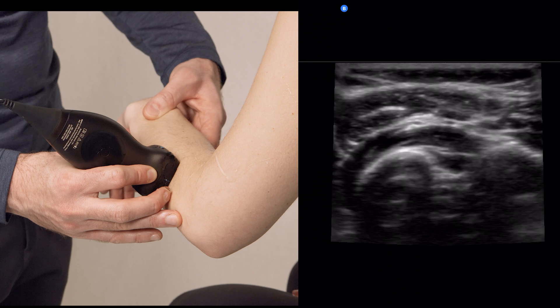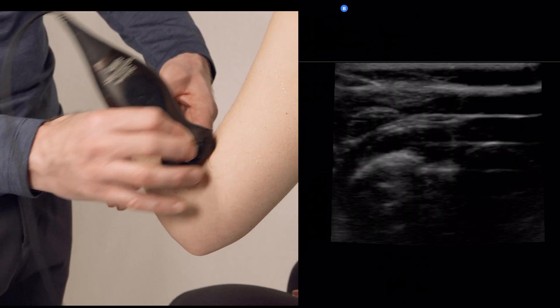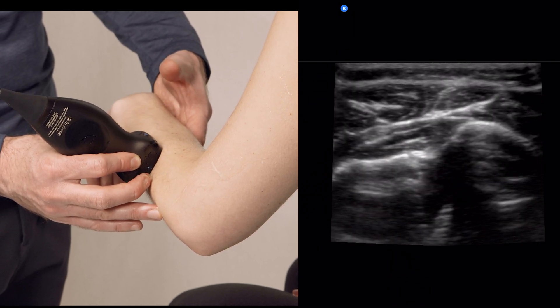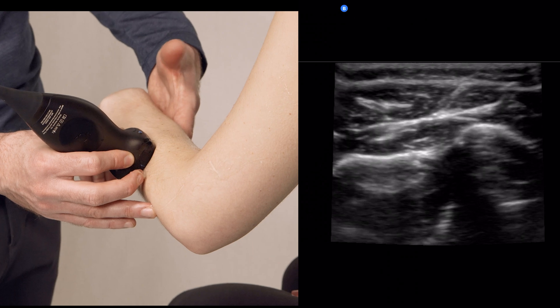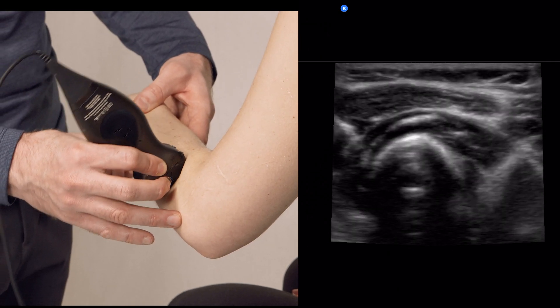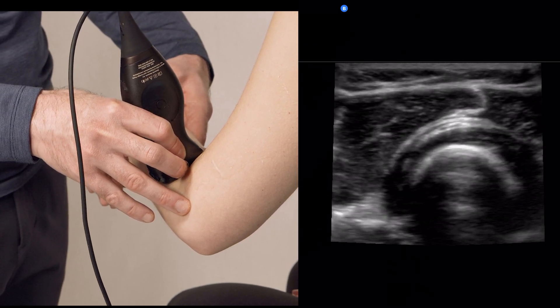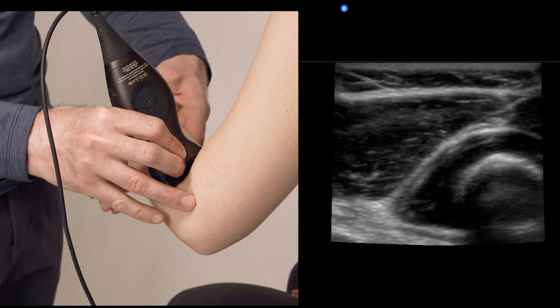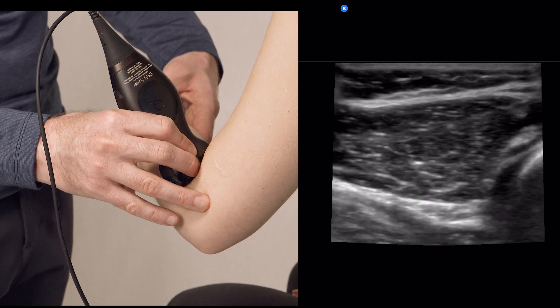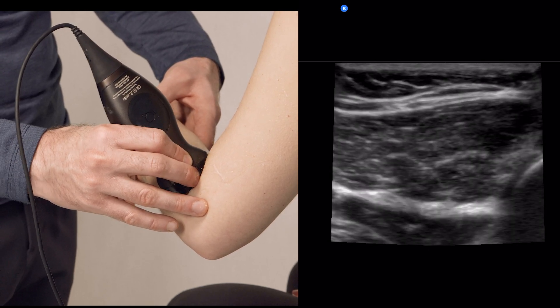The posterior interosseous nerve rolls around and comes out on the other side of the supinator. At that point it starts to split and lets off fascicles to innervate the finger extensors. Here it is going back through — the posterior interosseous nerve going through the supinator, and then down to the radial nerve itself.